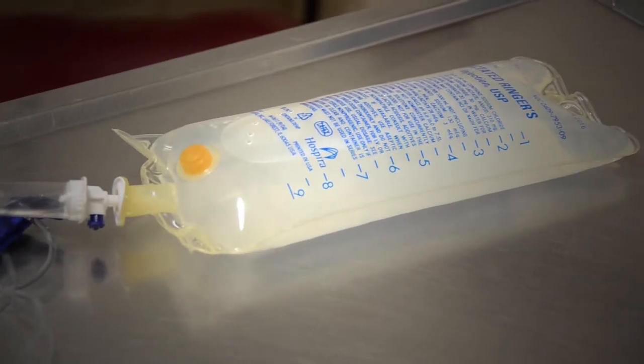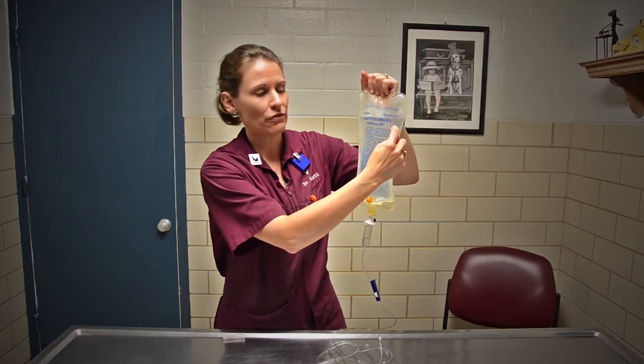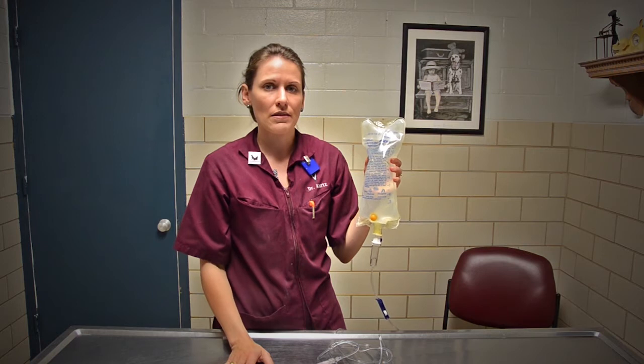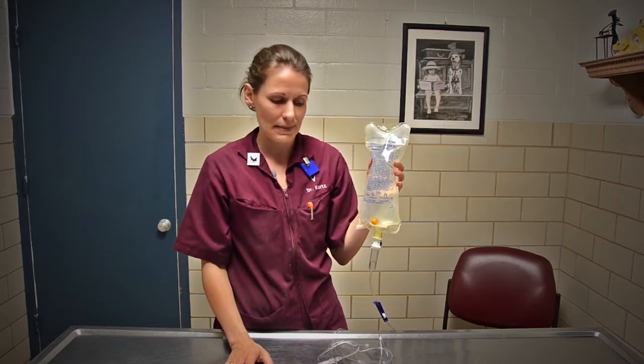Each number denotes 100 mLs. When you start from the top to the 1, that is 100. From the 1 to the 2 is 100, and so on. You will administer a quantity that is decided upon based on your animal's severity of the disease and weight.